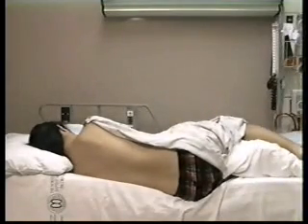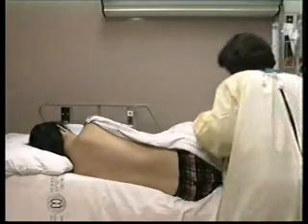Double-check to make sure you have everything you need. Have the patient draw his or her knees up to the chest to widen the spaces between the spinous processes. Use this method to find your target site.